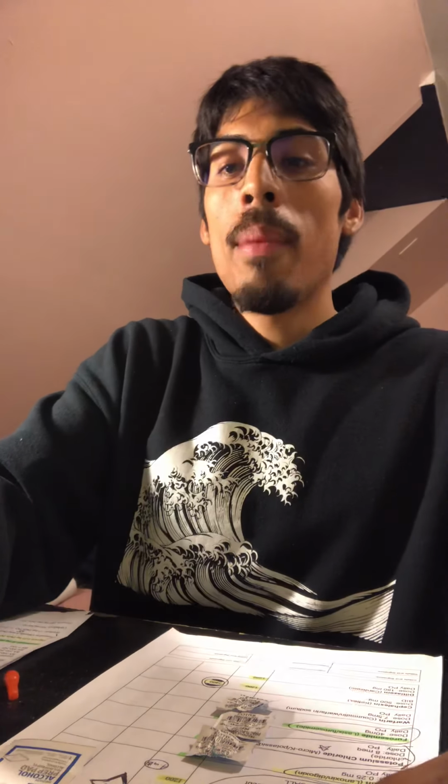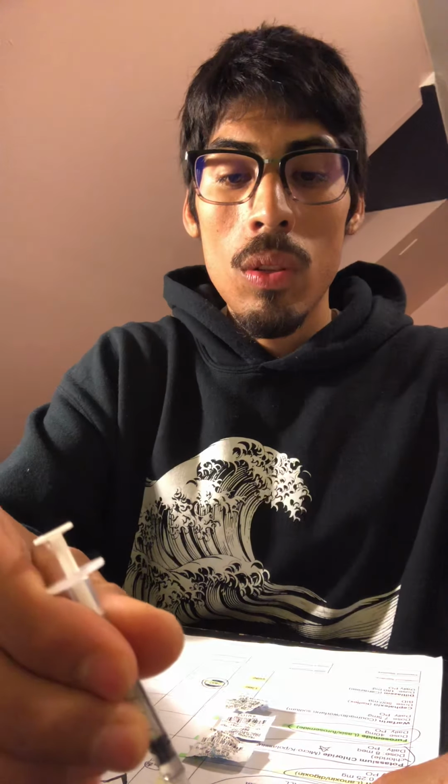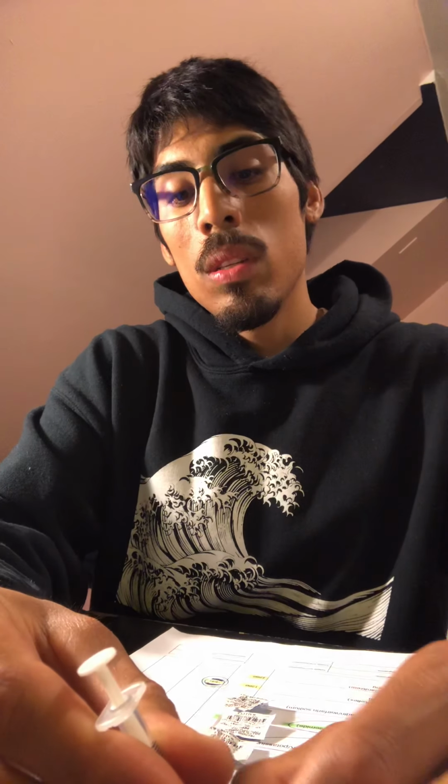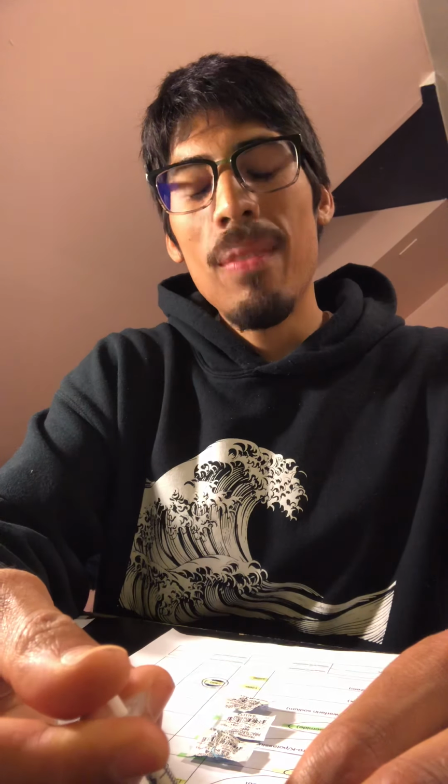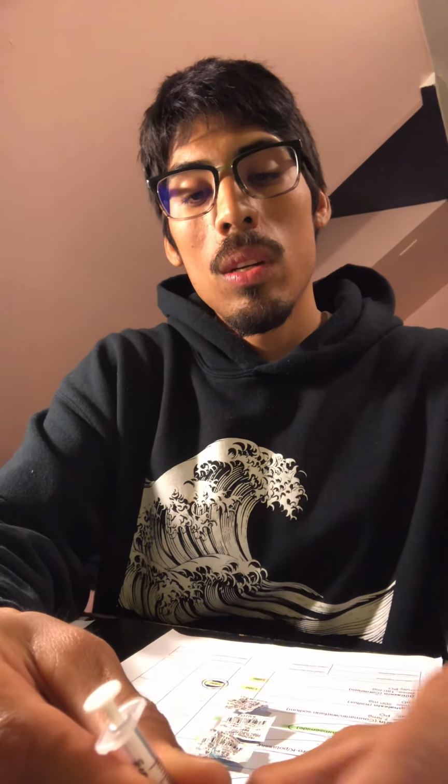And then so you're going to open this. You're going to grab on, you're going to say, hey, Mrs. Ford, here we go. 1, 2, 3. You want to hold on to your syringe. Insert 4 units. You want to wait for just a second. Okay. And take the needle out. You want to get rid of it in the sharps. If she's got some fluid or whatever, you want to make sure you can clean it up with 2x2. Put a band-aid on. Or if she's not leaking at all, just follow your protocol on that.